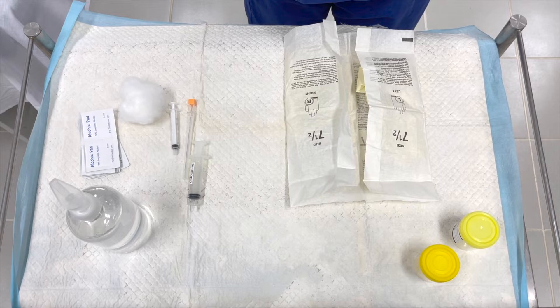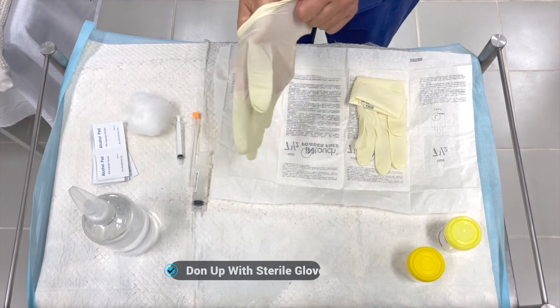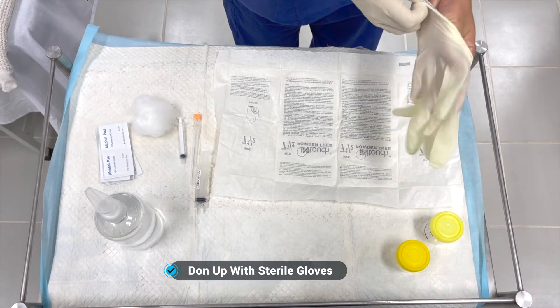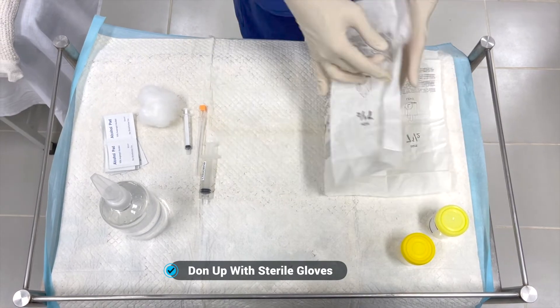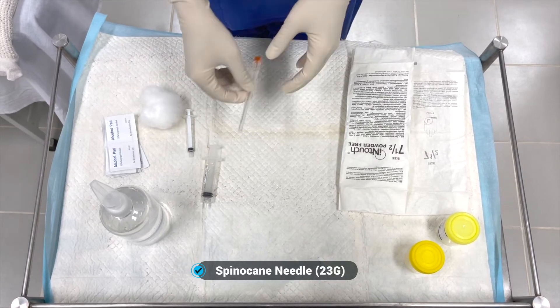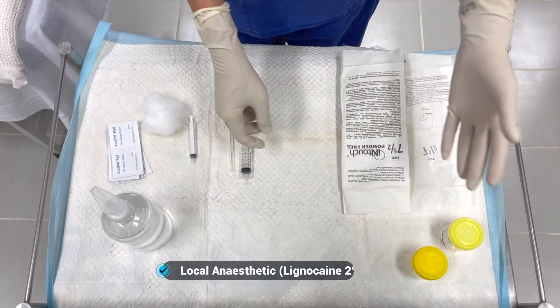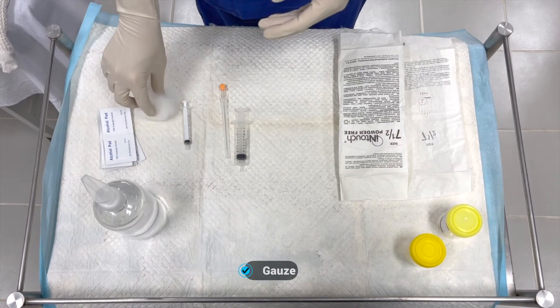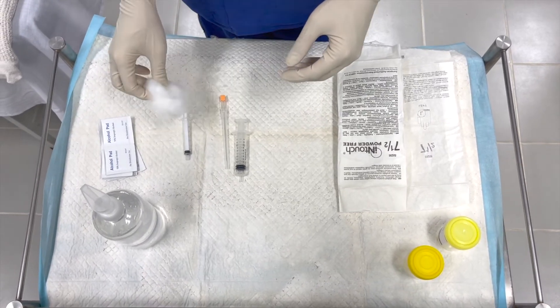I will show you how to perform a lumbar puncture. First, we must wear our gloves — make sure it's the appropriate size and worn correctly for our protection. In addition, make sure we have our spinal needle — usually we use 23 gauge — along with lignocaine for skin anesthesia, specimen containers, and gauze or cotton wool soaked with 70% alcohol to sterilize the skin prior to the procedure.